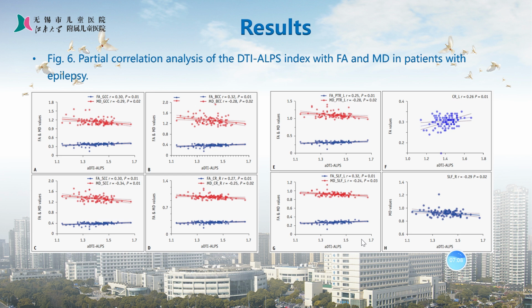The DTI-ALPS index was negatively correlated with MD, as these figures show.